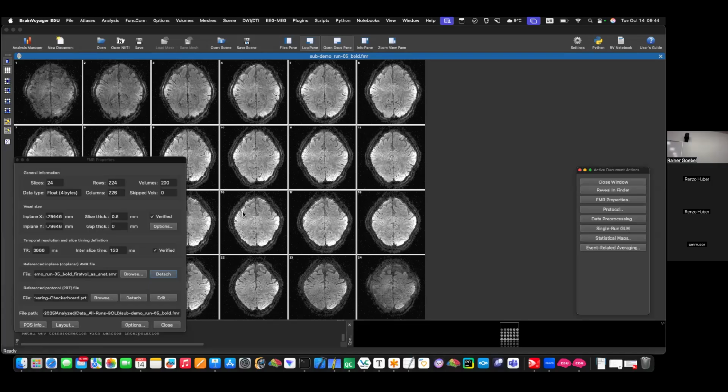But may I ask, so you already loaded the fMR? No. The Nifty will open this and save an fMR for you automatically. So I go to Open Nifty. You can use the icon or the menu. Go in bold and open the not preprocessed one. Just to show people, you just say open. You know what happens? It reads the Nifty. It takes a moment. There's the Nifty header.